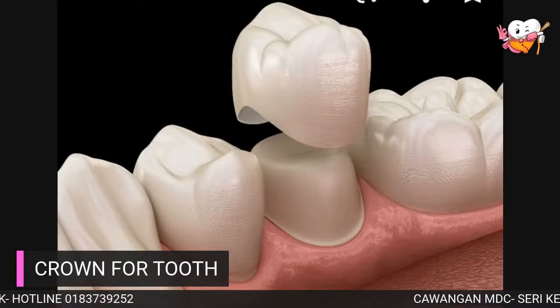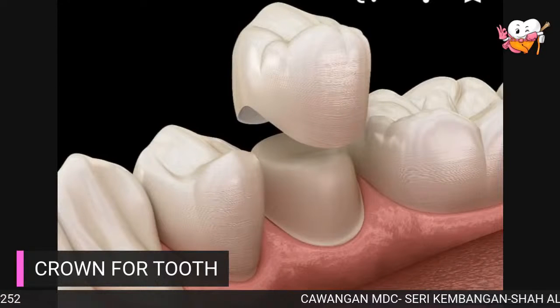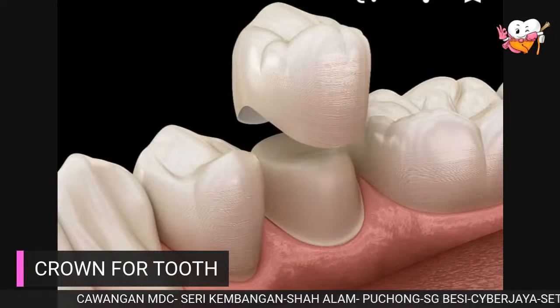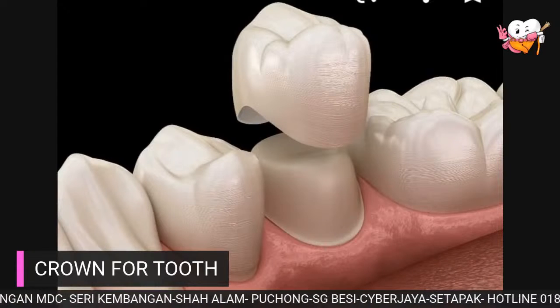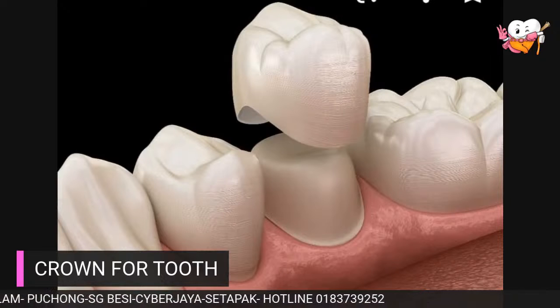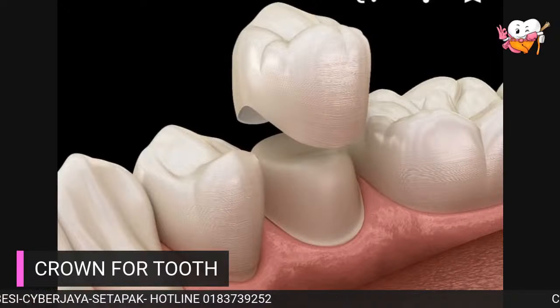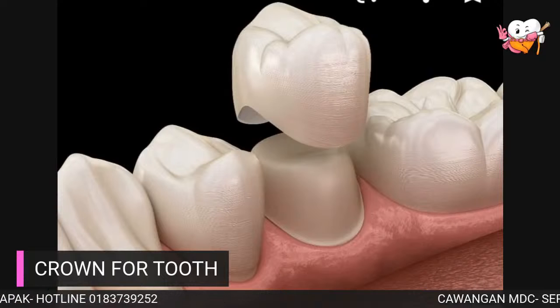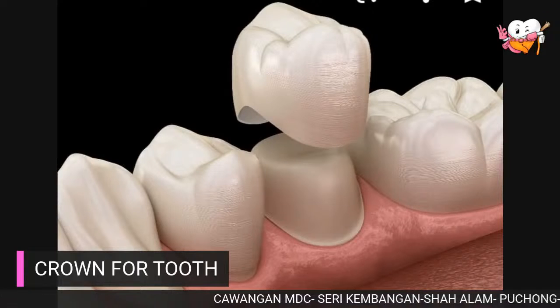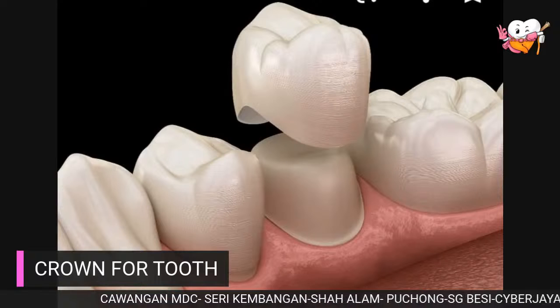When is it needed? It is needed when the tooth needs protection, when the tooth is weak. So for example, crown is used to protect or to cover or to restore a structure of a tooth when a normal filling cannot help or resolve the problem that the tooth has. So how is it done? Next picture.